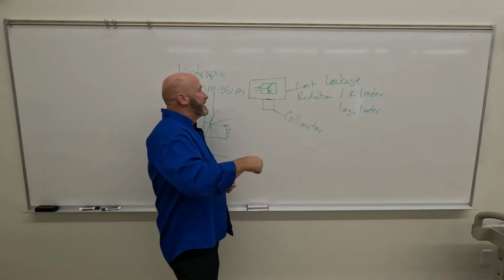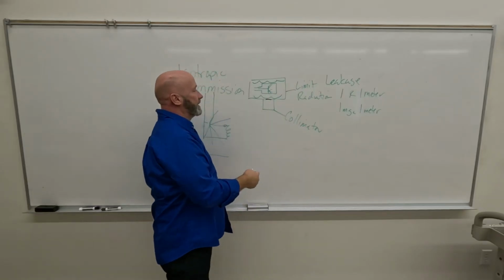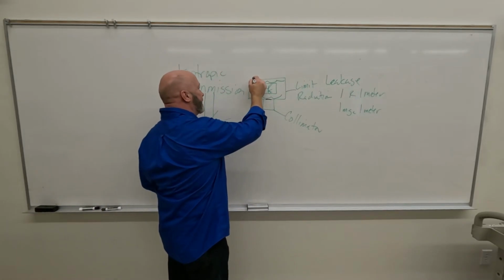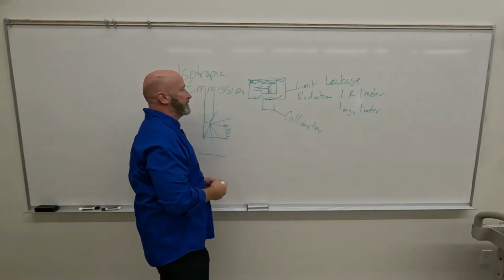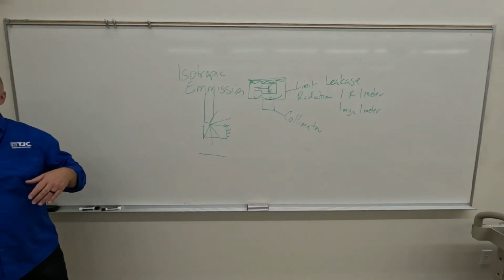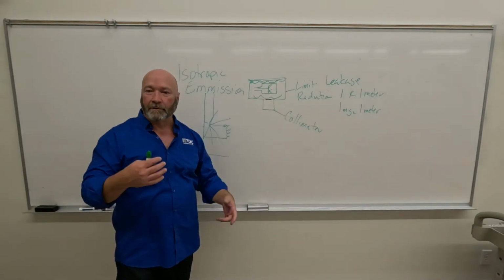So what we have inside the protective housing is the oil, right? And so we conduct the heat into the oil, and then we have that fan, and it may not be an active fan, it may be a bellows that blows across the oil to cool it down. The oil cools the X-ray tube down, so we're using all three.